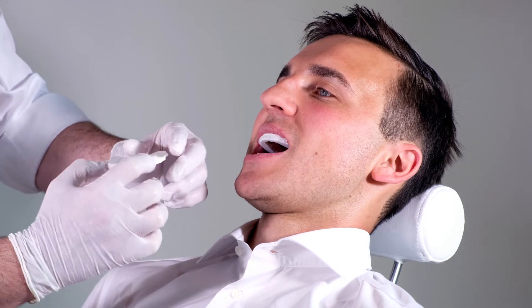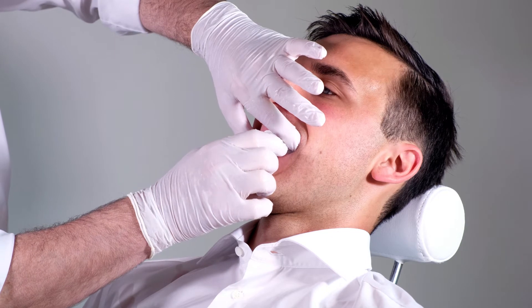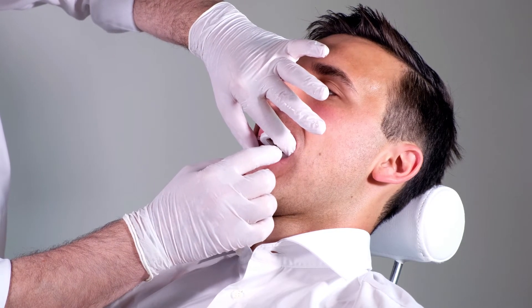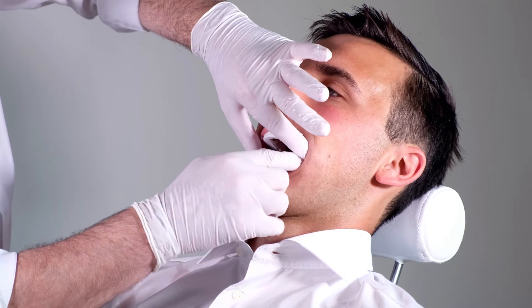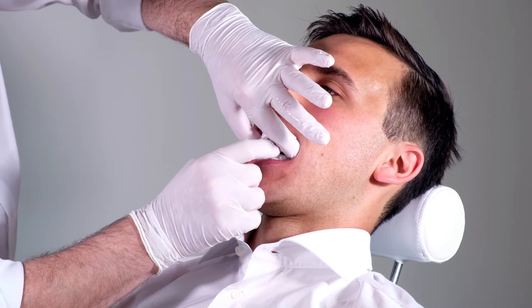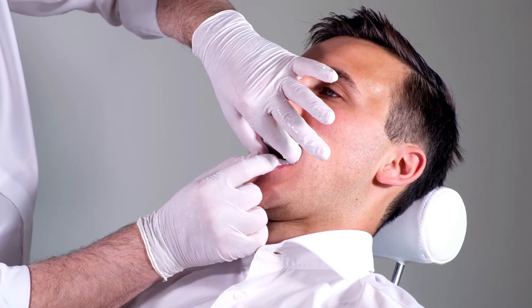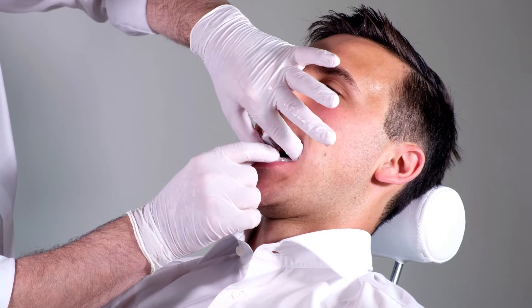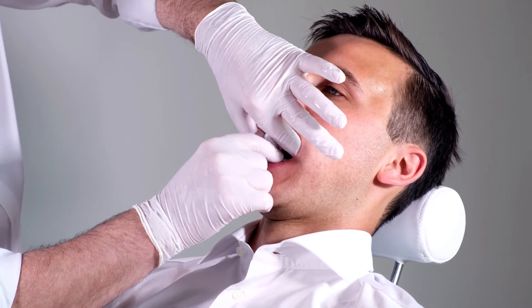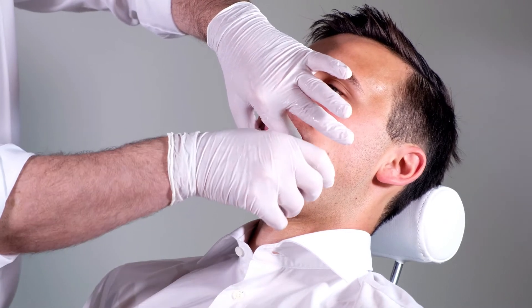Ask the patient to move their lower jaw slightly forward. Place the heated lower tray on the lower teeth. Make sure that the line mark on the upper and lower trays form a vertical line. If necessary, the width of the tray can be altered by gently pulling the fixation knobs apart or pressing them together. Keep the tray in place and gently press the thermoplastic material at the outer and inner wall of the tray against the teeth using your fingers.